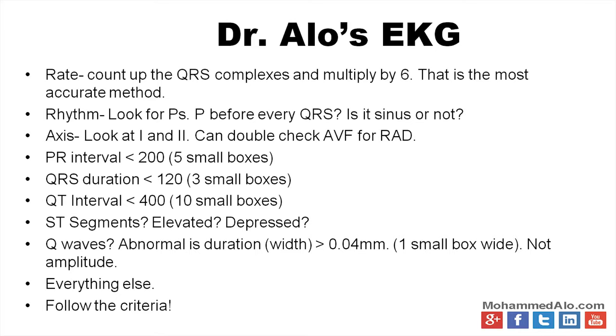Next, you look at everything else and always follow the criteria. I always tell people, follow that criteria. That's the most accurate way of determining what is really going on in an EKG.